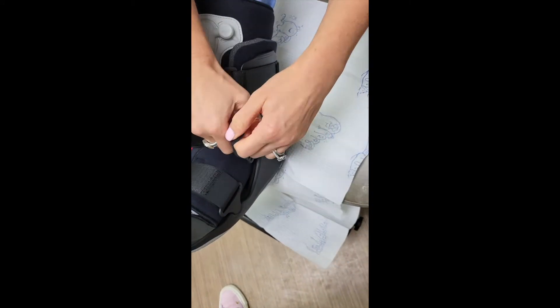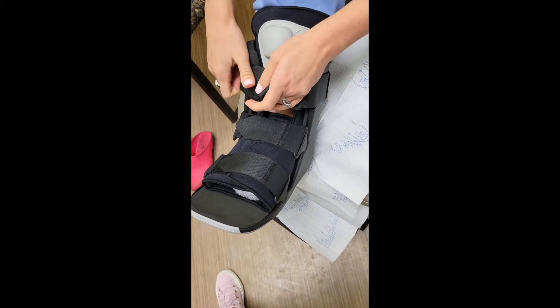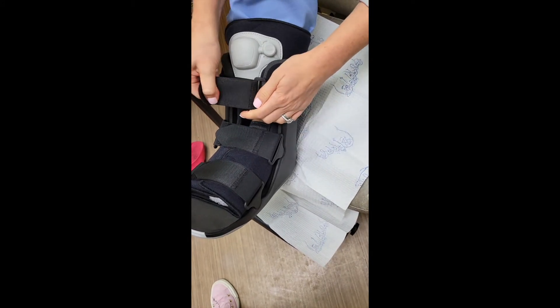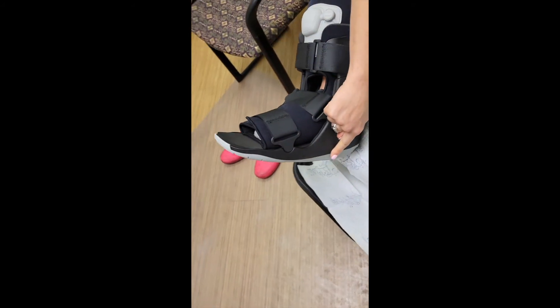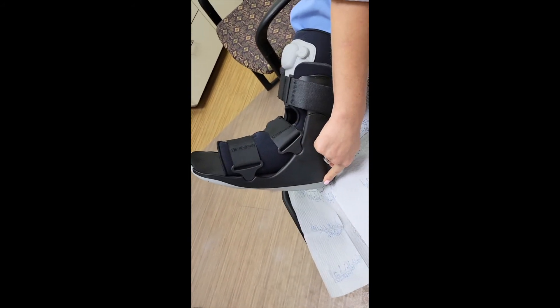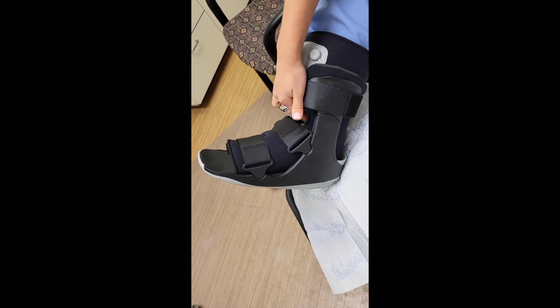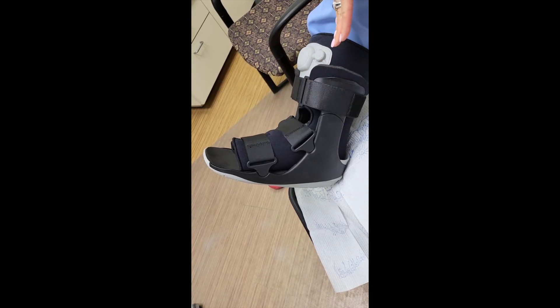When you're doing this you want to make it so that your foot will not slide in and out of the boot. When you're walking in the boot the curved part at the bottom is what's going to allow you to move. You're not going to be moving your ankle, so you do not want to be able to flex your ankle or slip your foot out of the boot.